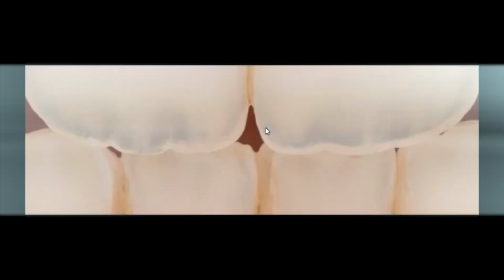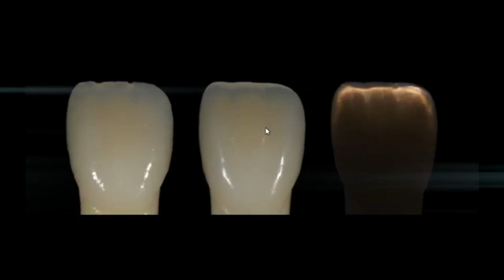Properties, because on the incisal third is critical to get this kind of effect. So this is an example of layering of composite, and you can really see the change when we are doing this polishing and this finishing. We can create this halo effect just by modifying the shape of the tooth. Okay, this is possible to do also with composite. We just need to try to copy what we see in nature. If we use the right materials, you just need to copy the anatomy, and that's it.